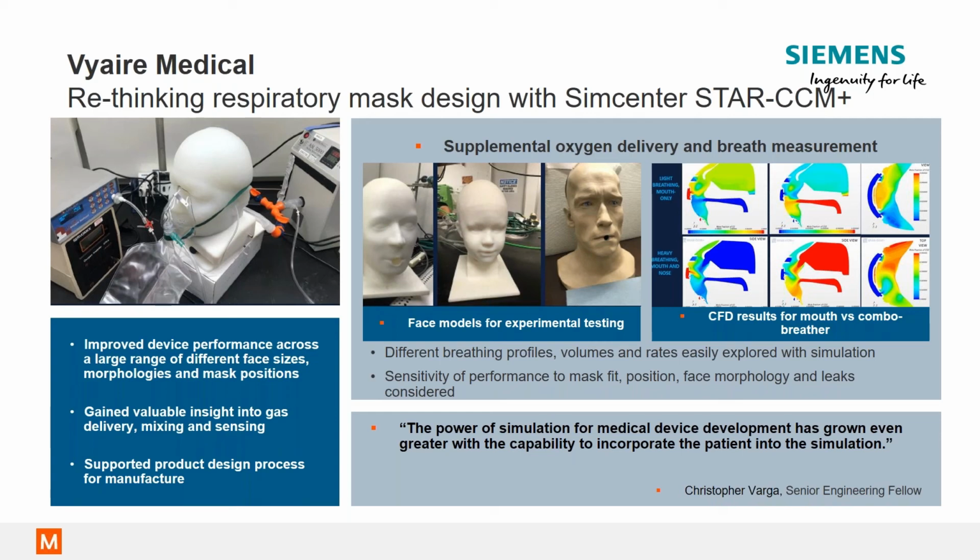So to gain more insight about the gas mixture and especially CO2 concentration at the end of exhalation, they ended up modifying their design and adding a sensor, and its position was determined by CFD. CFD was also used to change the position of the oxygen port in order to maximize the oxygen delivery to the patient.